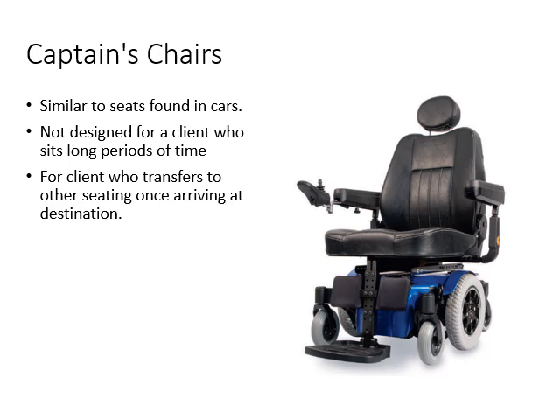Here is a captain's chair. It's a similar seat to what we find in our vehicles. It's not designed for a client who's going to be sitting for a long period of time because it's not customized. It's for somebody who's going to transfer to another seat once they arrive at their destination.